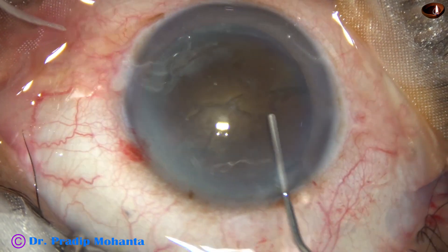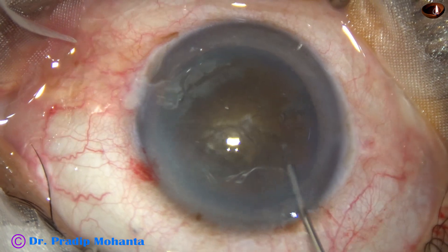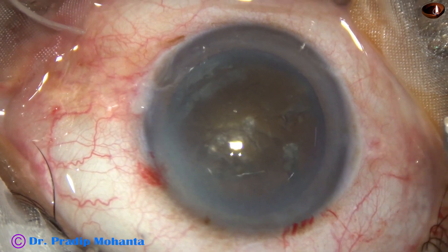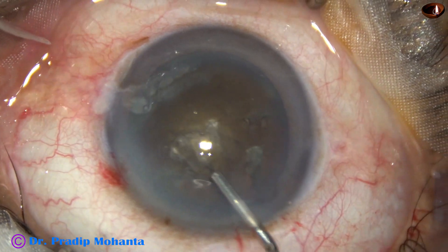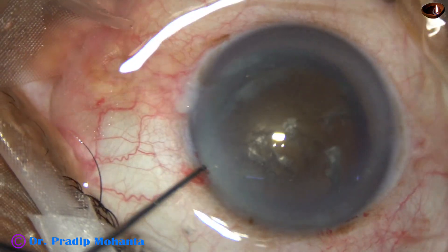Hydrodissection is done very gently. Small aliquots of BSS are injected at several points. The nucleus is stabbed and the nucleus is rotated. The anterior chamber is again filled up with viscoelastic.